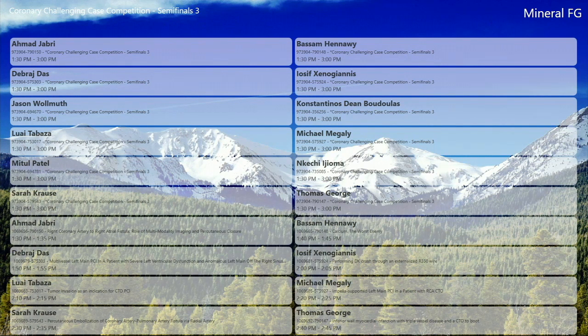Quick question. I'm curious, do you guys have balloon pump availability there, and what was the thought for not using it in a CTO to LAD, culprit right, critical circ? We have an IABP, we don't have an Impella. So in fact, it was kept ready. The patient's hemodynamics were good and it was not in failure. We are confident that in case an IABP is required, we can put it in fast. So it's all kept ready.